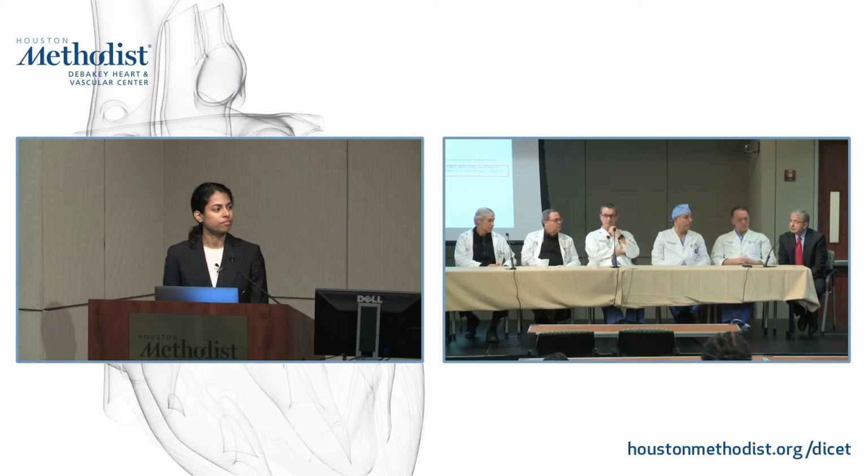I would agree with Gerald that if the decision, irrespective of what the finding is, is to go to surgery, you really don't have to do a CT angio. You could go for fluoroscopy, and it confirms for you that indeed it is a dysfunctional valve, and then you proceed with surgery. But if the issue is this thrombosis, is this pannus, or most likely a combination, a CT angio would be very good because it tells you about motion as well as whether there is a thrombus on it, to help you ultimately make that decision.